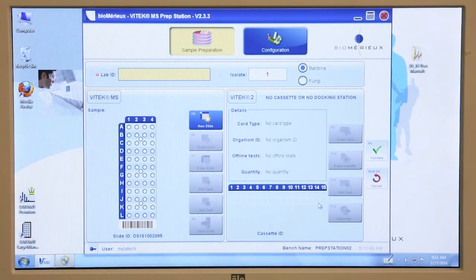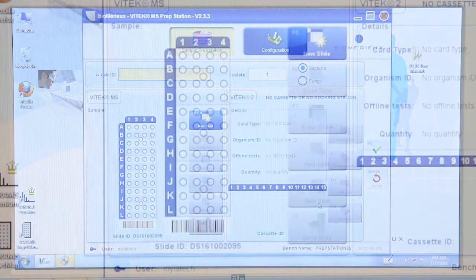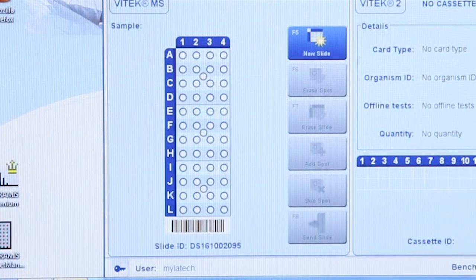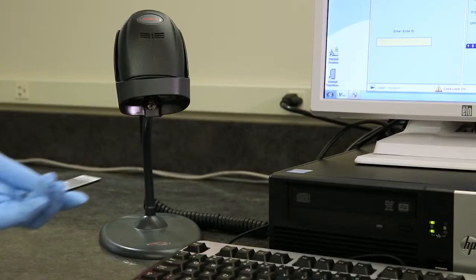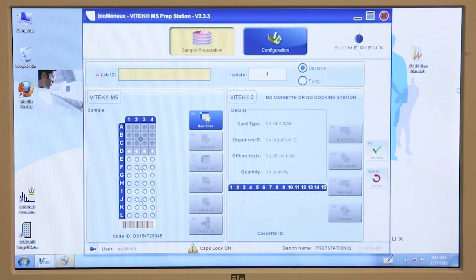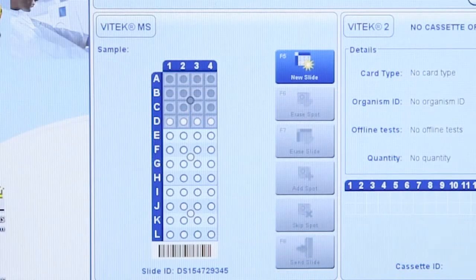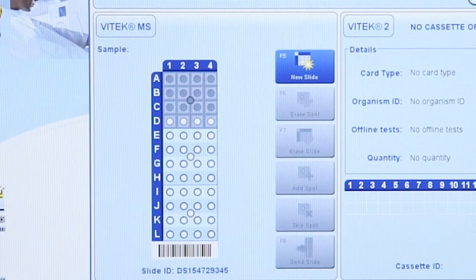Once entered, the screen changes and displays an image of the target slide. If the slide has never been used for testing, all spots appear as empty circles and are available for testing. If any acquisition groups on the slide have been used previously, they will appear grayed out and are considered blocked.